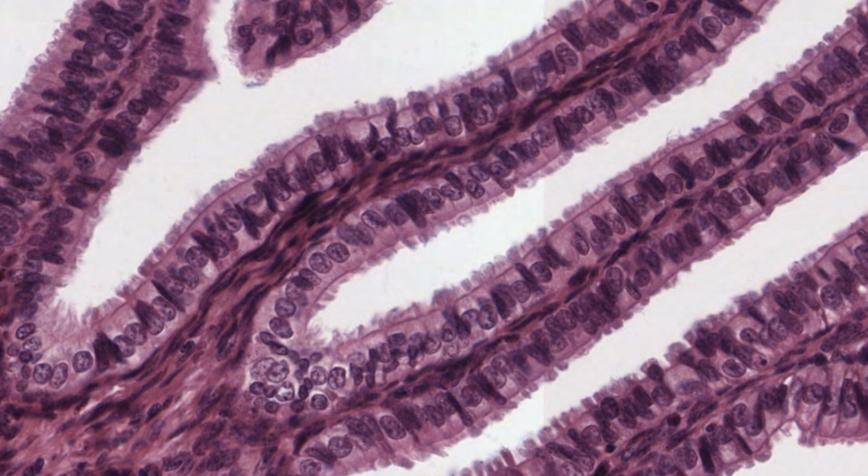So, my dilemma here is because this epithelium undergoes cyclic hypertrophy during the follicular or estrogenic phase and atrophy during the luteal or progestin phase of the ovarian cycle.